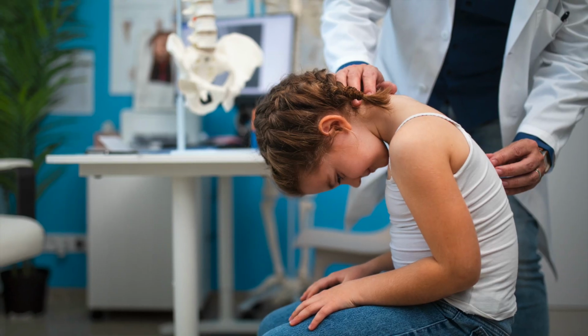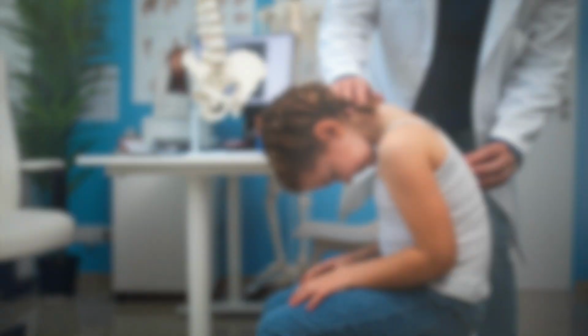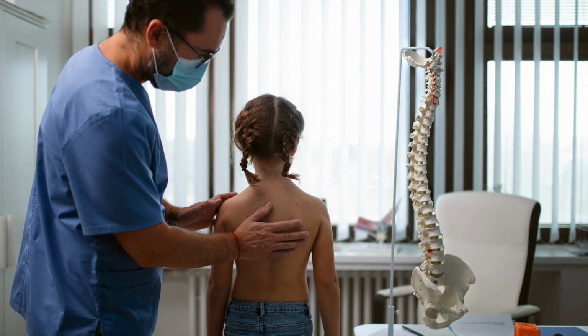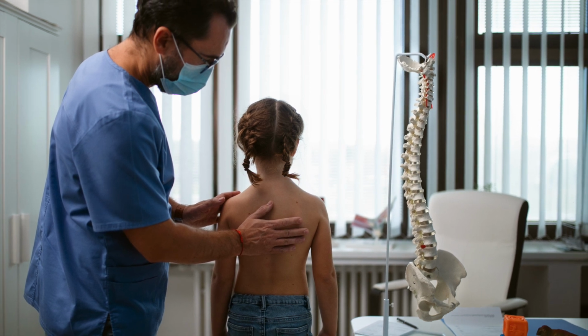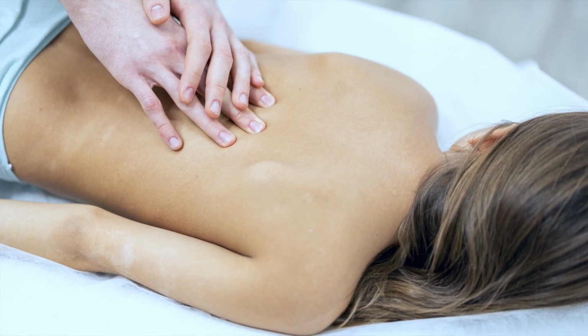That's assessed by both the anaesthetists and the surgeons. During the operation, the anaesthetists need to administer an anaesthetic that is safe, and their blood pressure and respiratory function is all safe, because there's a lot of pressure on the organs during the operation. And from a surgical point of view, we can still do the operation despite the fact that it's a custom-made bed. So that's one way of assessing it, and that all went very well. We're very happy with that.